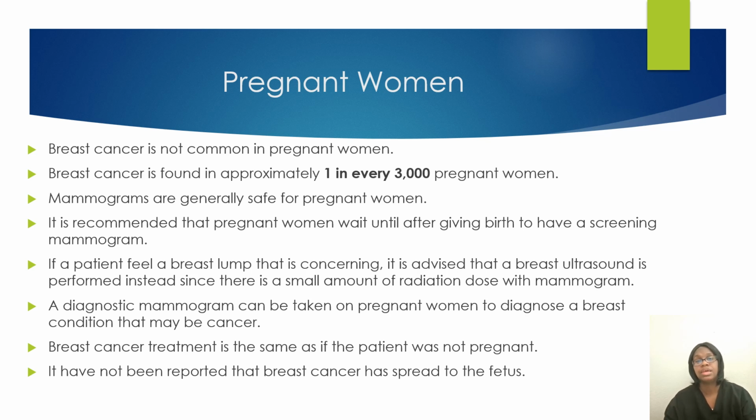For pregnant women, just check with the radiologist to see the best way to go about imaging a pregnant patient, depending on what they're coming in for, their symptoms, their problems. Always check with the patient first to even see if they're pregnant, whether they're 30, whether they're 55, still ask. And then if they are, ask your radiologist what you should do, if they should have the ultrasound first, or if they should have the mammogram, or if the mammogram should be canceled until after they have given birth. The point of contact for questions should be the radiologist first.